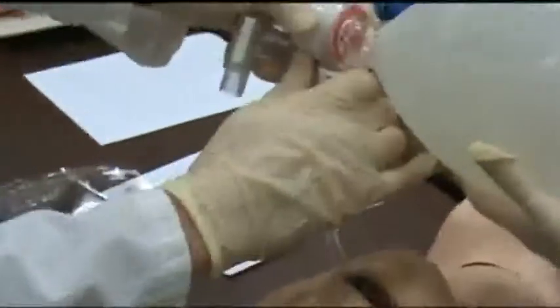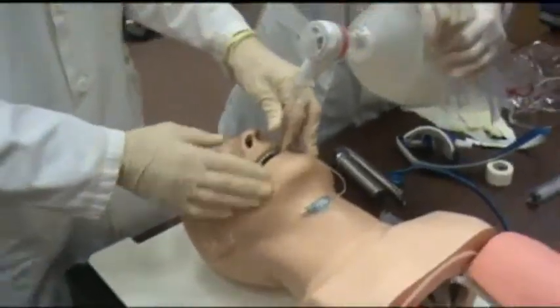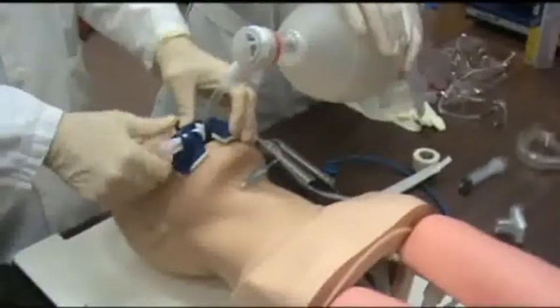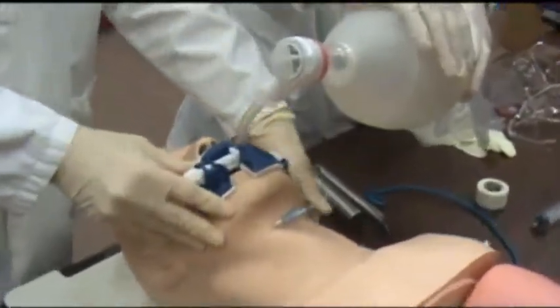Using the end-tidal CO2 detector — capnography — you can confirm correct tube placement. These are usually computerized these days, but some providers still carry the colorimetric type. Then you secure the tube using a commercial device or tape, wrapping it around to hold the tube securely in place.